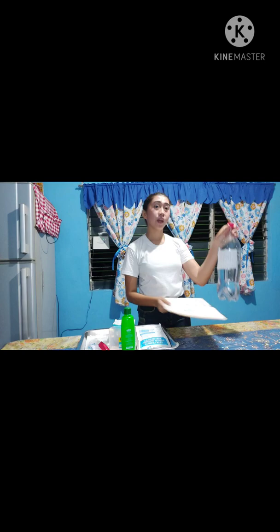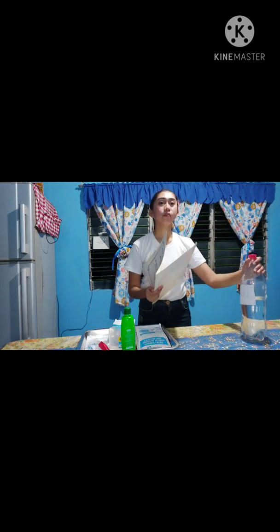So the next thing that we're going to do is to compare the information on the label of the solution bottle with the doctor's order. So this is the doctor's order and the solution bottle, and this is for the compatibility of the solutions that are mixed. And it is also done to avoid any medical errors.